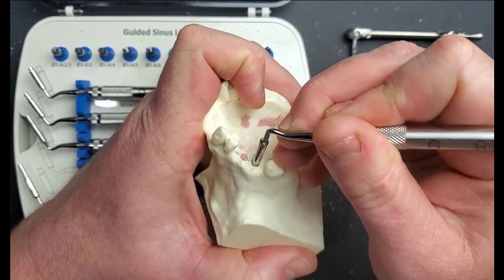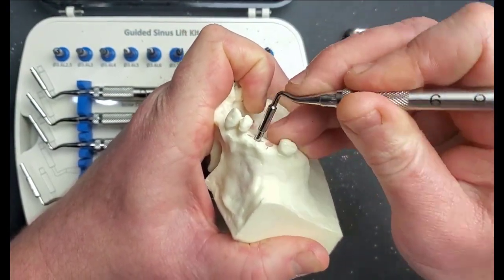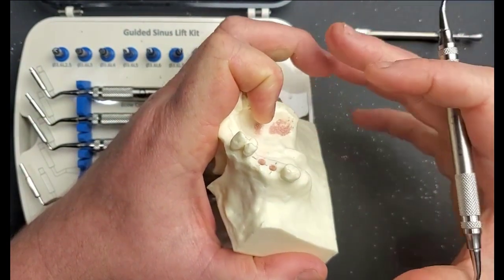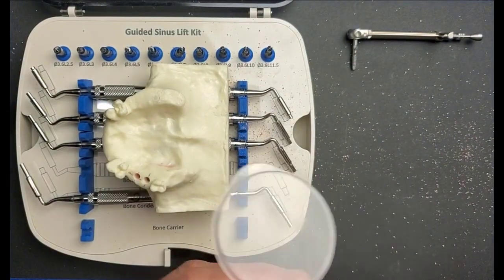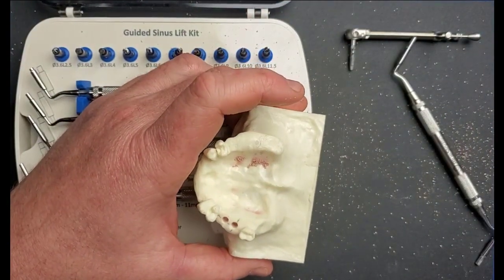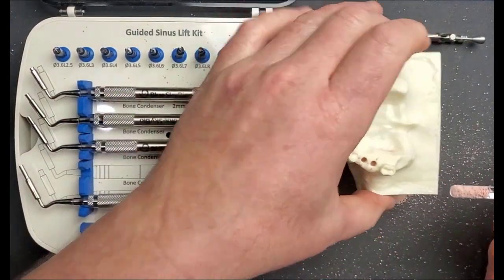By doing it at the eight-week mark your osteotomy will not be fully closed in with bone — you'll still have that there but with a plug of tissue. You can go straight to the lift and use your condensers to push that plug of tissue up through the osteotomy, connected to the bottom of the sinus membrane, and lift that entire complex up, then do your implant placement. I'll time-lapse this — doing about three or four more loads of bone to get enough lift and then we can place the implant.